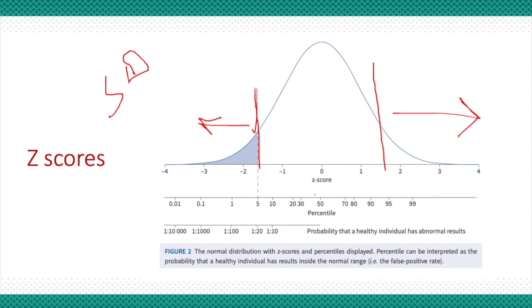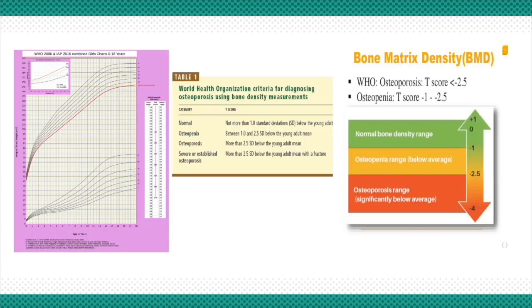From the standard deviation, the Z-score is estimated, and the Z-score basically implies what chance a person has that his result will fall within the distribution of normal healthy individuals. Similar to the Z-score, previously as well, in the growth chart for the pediatric population, and in the osteoporosis score using T-scoring, we have used standard deviation to define what is normal and abnormal. So with the 2021 interpretive guideline, we are trying to do the same for pulmonary function tests, and rightly so.